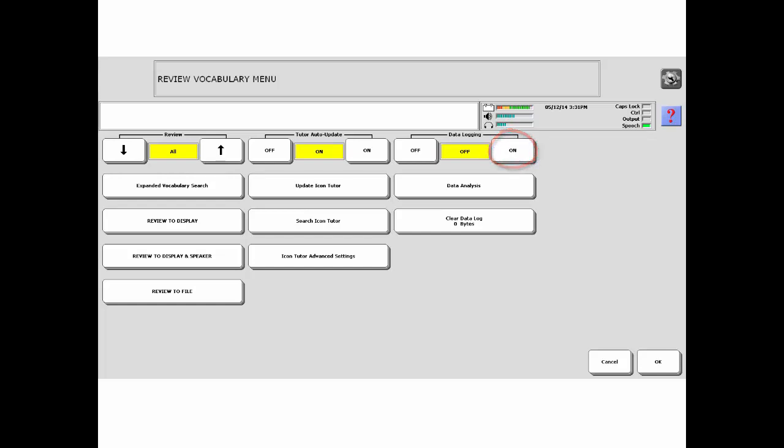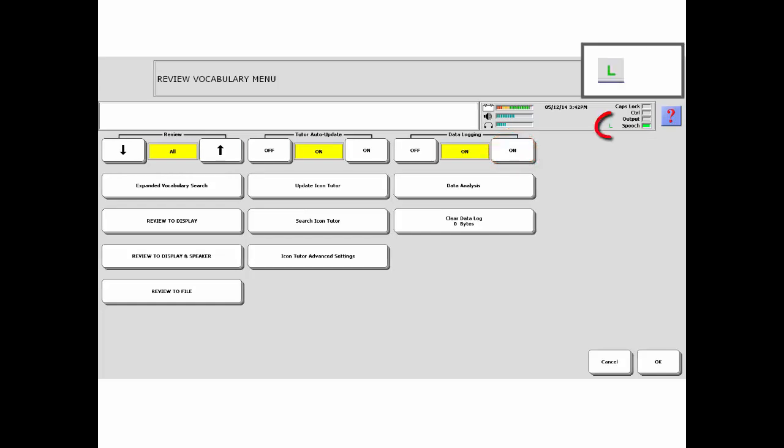Now select On under data logging. You will notice a green L or this red symbol in the status bar. This indicates that data logging is on.